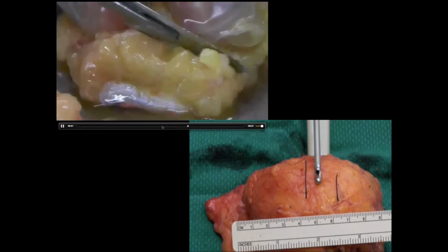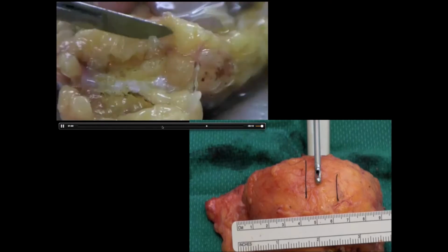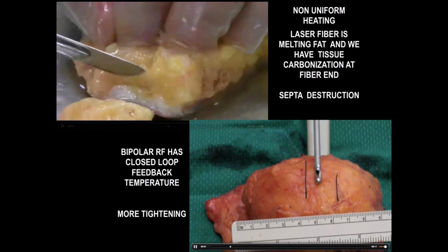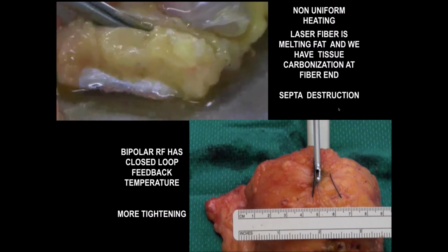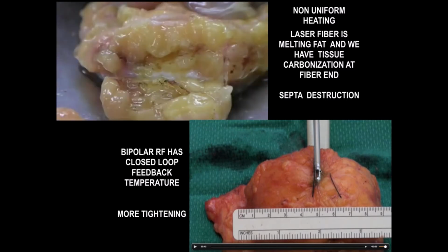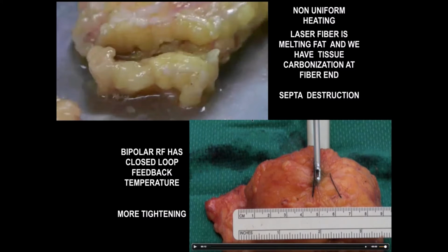You have some, but not as much as you can have with a bipolar RF, because I have thermal containment among the 2 electrodes. So that's what you are seeing. But now look at the below, you can see I'm starting now with this one. Look at here, and you have a tightening effect. So now look, the pop-up effect. I'm melting some fat, but with more tightening. I don't have any destruction of septa because I have closed loop feedback temperature. So I stop at 70, and you know that at 70 we don't have any destruction, because from 80 to 90 degrees you will have the destruction of septa and melting fat. So if I stop at 70, this is why. The reason is that it's not like a laser fiber, we have a closed loop, bipolar, and we have more tightening.